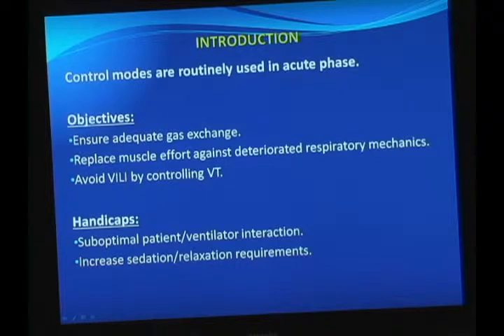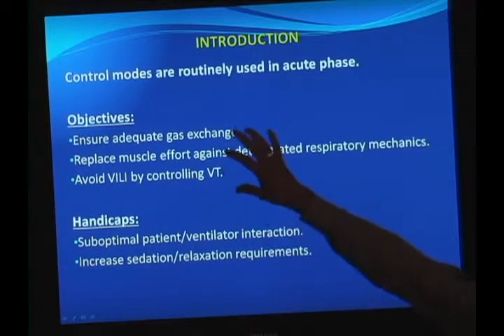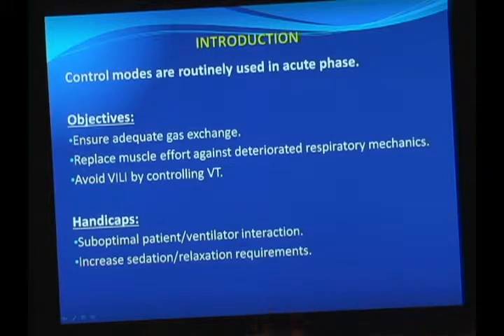But you also know that there are side effects, because there is suboptimal patient-ventilator interaction. You have to be very expert in mechanical ventilation to set the machine in assist control mode to clearly match the ventilatory needs of the patient. And when nothing works properly, we need to increase sedation or even relaxation. Humberto has just reviewed for you that those periods of absolute lack of activity of the diaphragm can have long-term deleterious effects in terms of atrophy. So maybe this is a good part, but we have to balance the side effects of the other one.